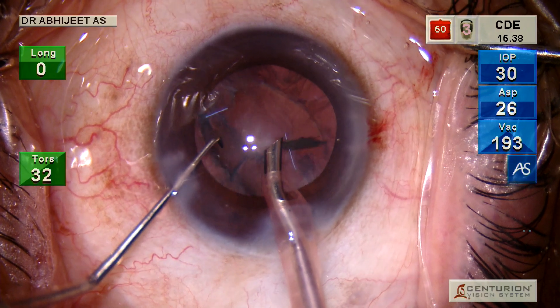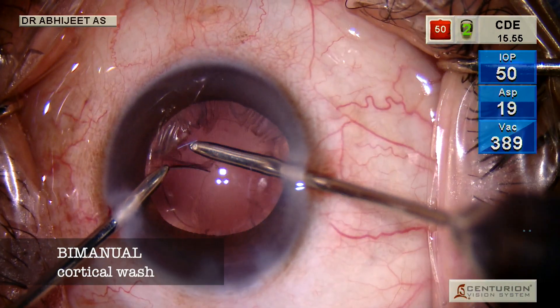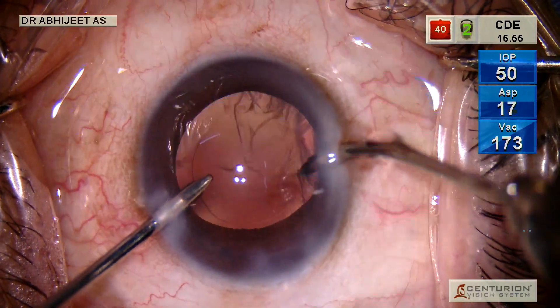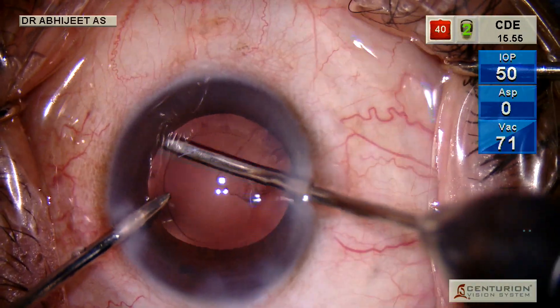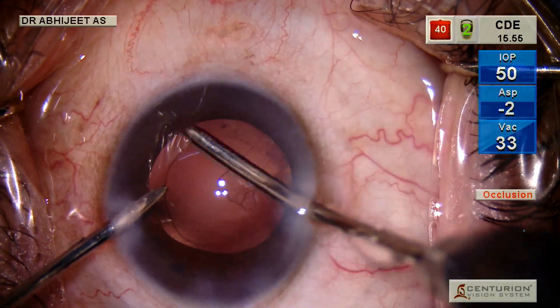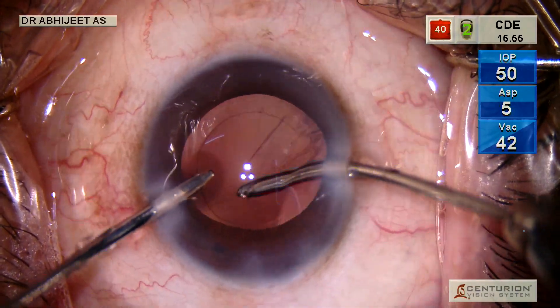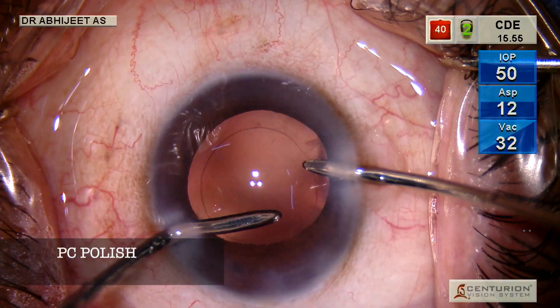Now if you realize, there's one piece which has just flown off and gone hidden somewhere. We do the bimanual wash, cortex wash, and then the anterior capsular polishing and PC polishing as well — removing whatever remnants of epithelium are there on the PC so that you don't get a PCO.